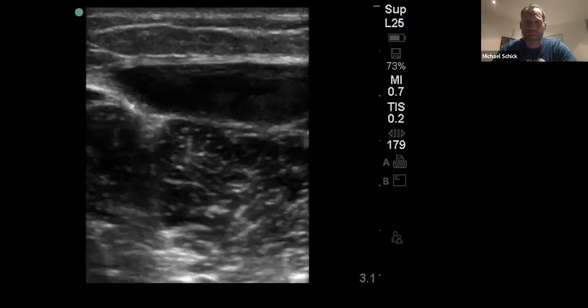This is the ultrasound of the right lower quadrant of the abdomen, with the linear probe, so what I care about is superficial. I can't really use my mouse when I'm presenting here, but going from top to bottom, you have the epidermis, the hypodermis, and the intra-abdominal or rectus muscle there. Right below that, you have this big hypoechoic, almost anechoic fluid collection. And then below that, you have the peritoneum with the intestine.